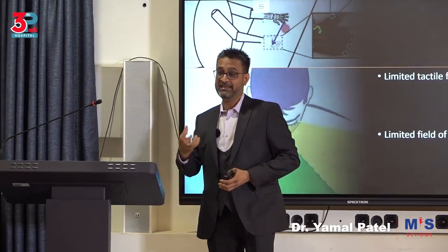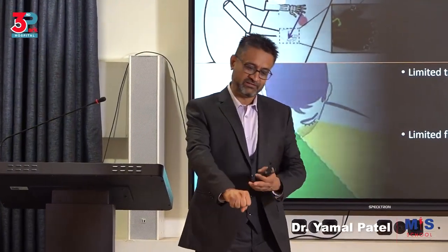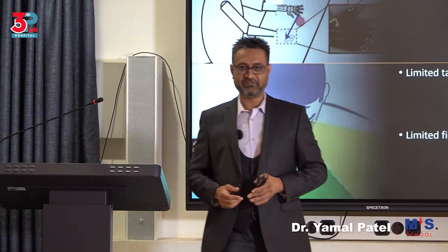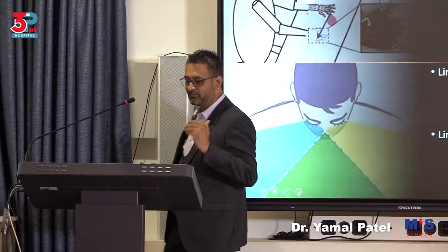So in an open surgery, you'll palpate the uterus and say, I feel something here. Make a cut and remove it. You need to plan differently for MIS. So these few things should be important.